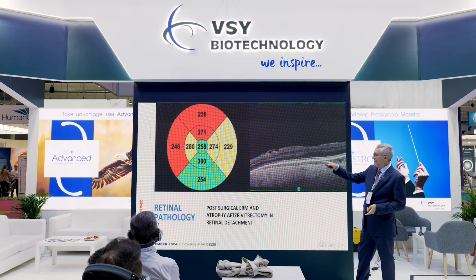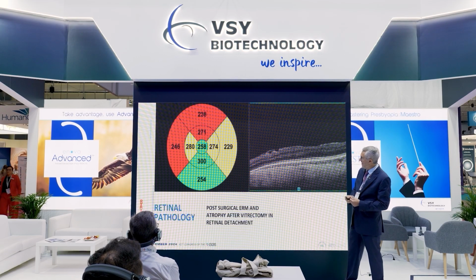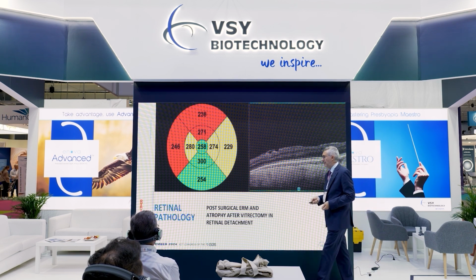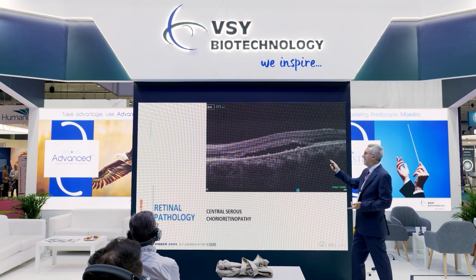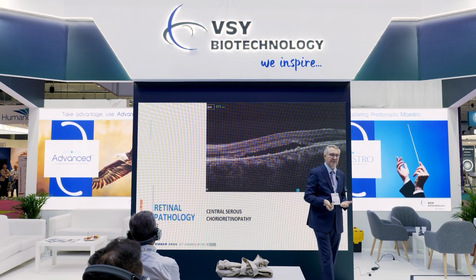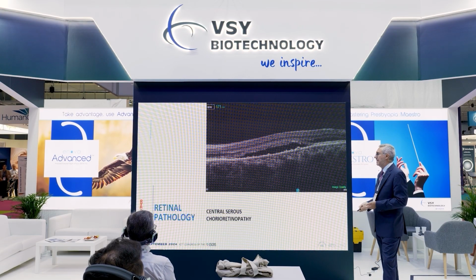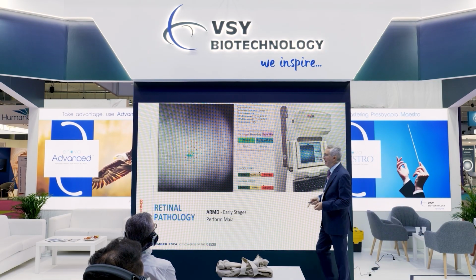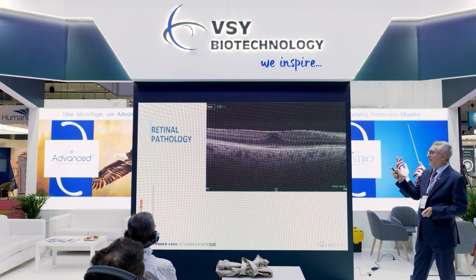In spite of atrophies in the central area after retinal detachment, with, for instance, this patient who was referred to us with a glaucoma and a retinal detachment, we analyze the central function with the Maya. We are assuming that those patients who had those retinal pathologies might see them recur. But in spite of this, we can provide them with a good solution whenever we have a good central fixation test.